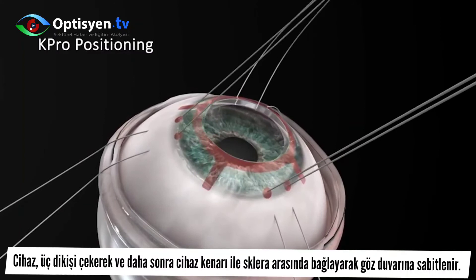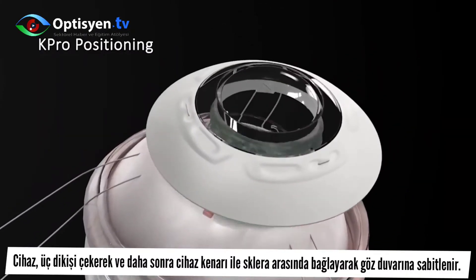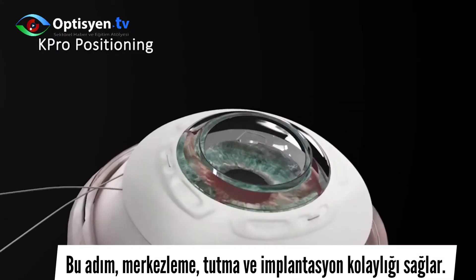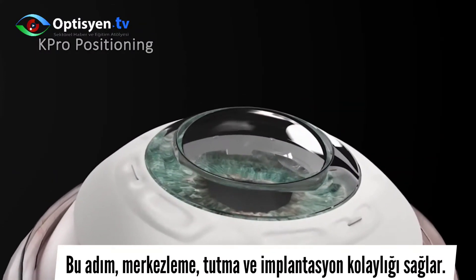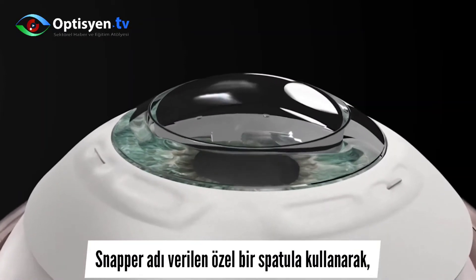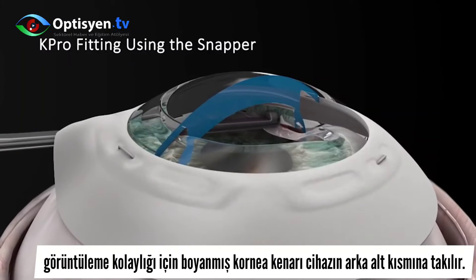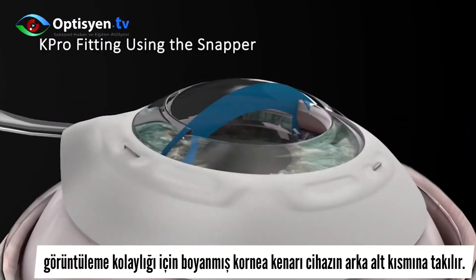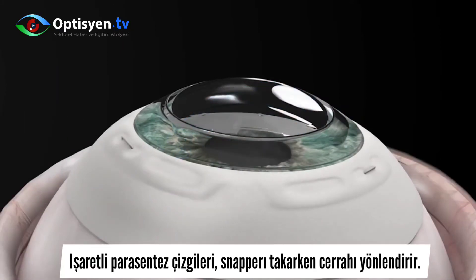The device is fastened to the eye wall by pulling out the three sutures and then tying them up between the device skirt and the sclera. This step ensures centration, retention, and ease of implantation. Using a dedicated spatula called the snapper, the corneal rim, which is stained for ease of visualization, is snapped into the device's posterior undercut. The marked paracentesis lines direct the surgeon when inserting the snapper.